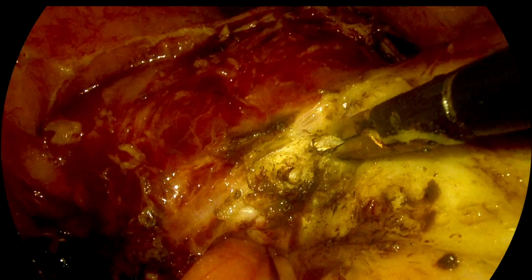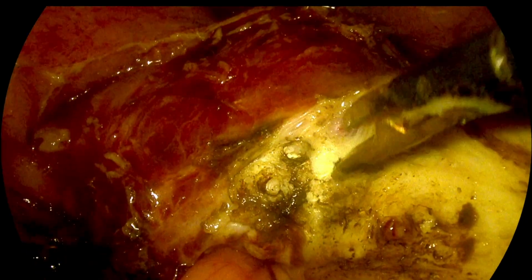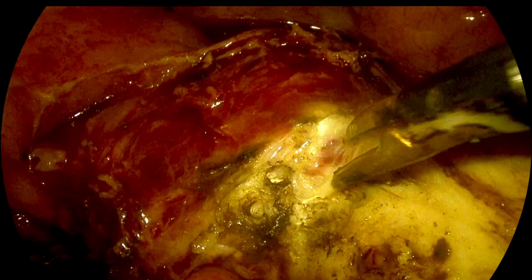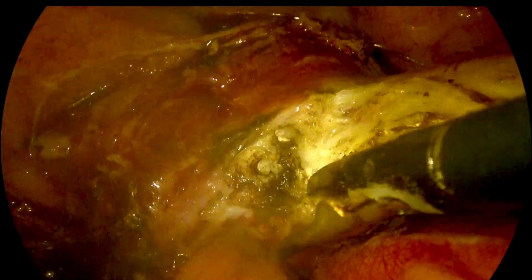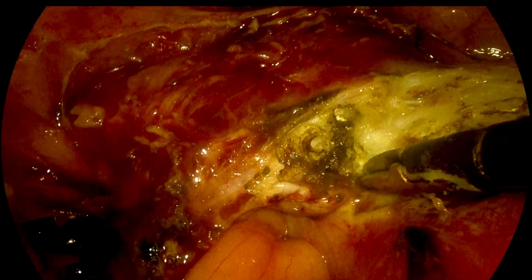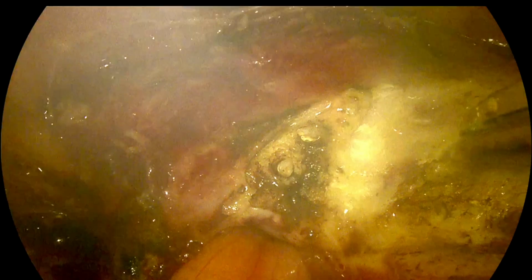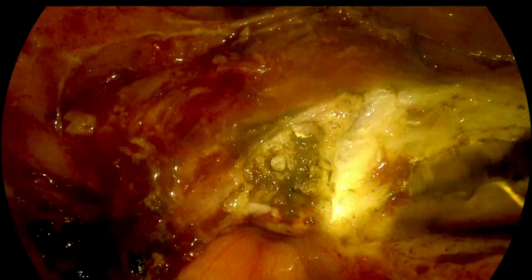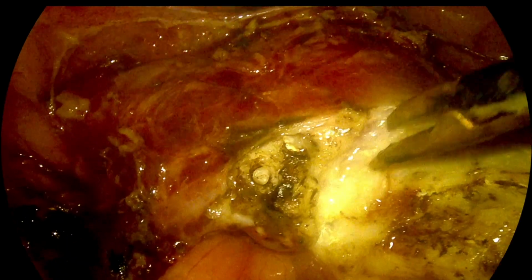We can see now we are able to divide the uterine artery. We coagulated it, waited for at least 1 or 2 minutes, and by that time we were dividing the other part of the surgical area. Once you are satisfied that the vessel is completely coagulated, only then do we divide it. You can see the cervix looks a little broader. The cervix is a little hypertrophied.